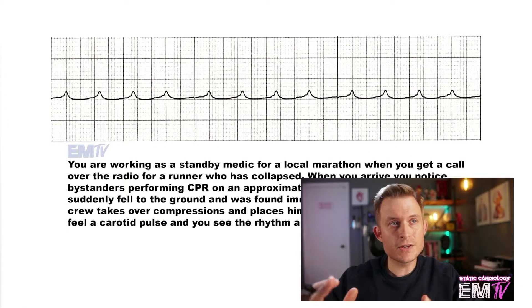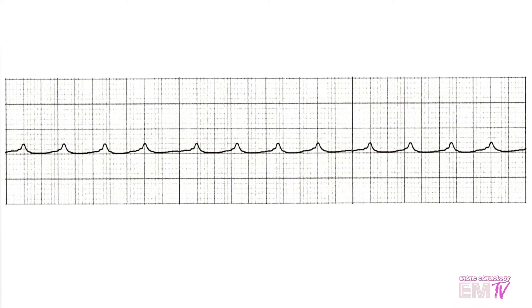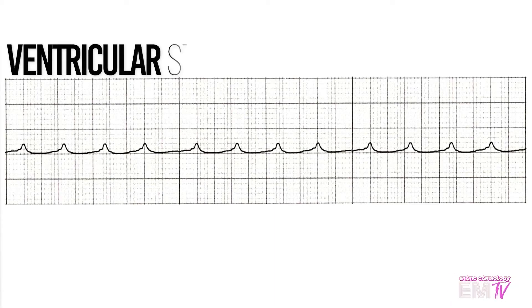So this is definitely not a good scenario to have. Let's go ahead and take a look at the rhythm and see if we can identify it. Normally the first thing I do when identifying a rhythm is to calculate a rate based on counting the R waves. Unfortunately there are no R waves present here. What I am seeing though are P waves with absolutely no ventricular activity. Because of this, my diagnosis of the rhythm is going to be ventricular standstill.